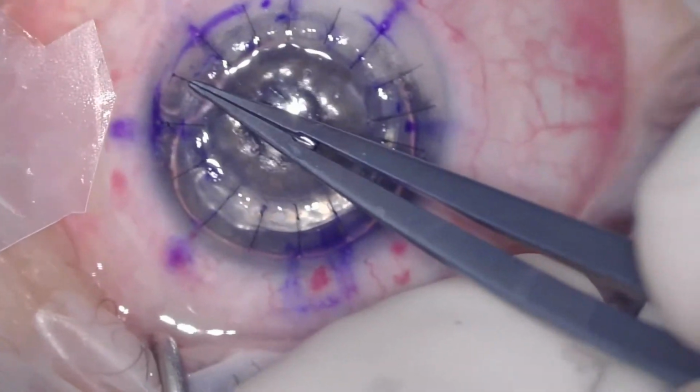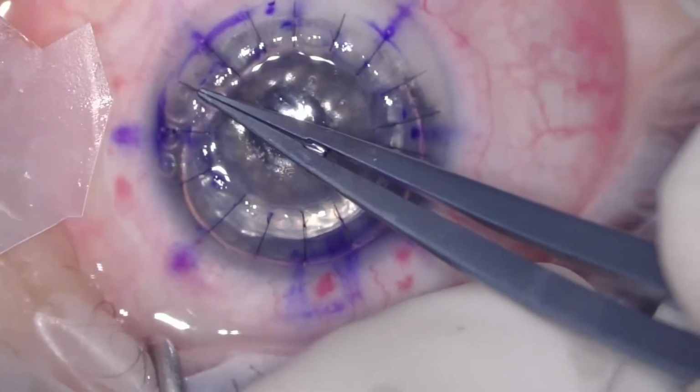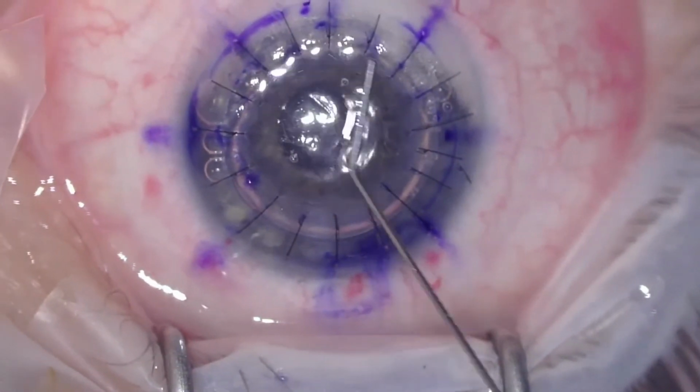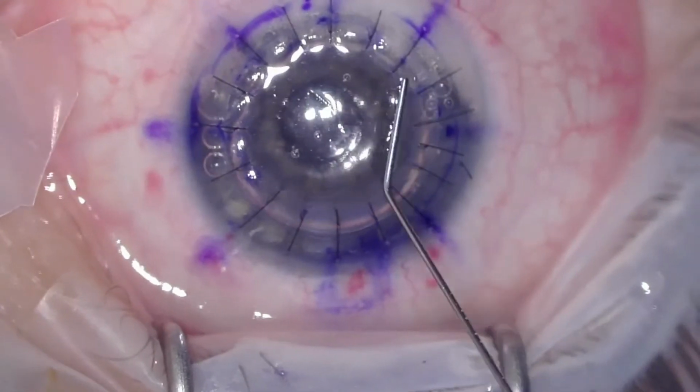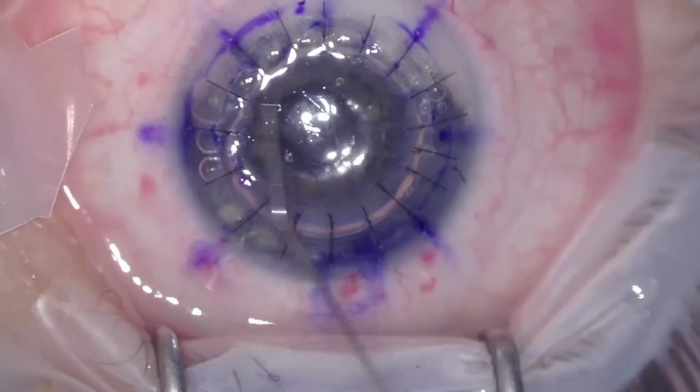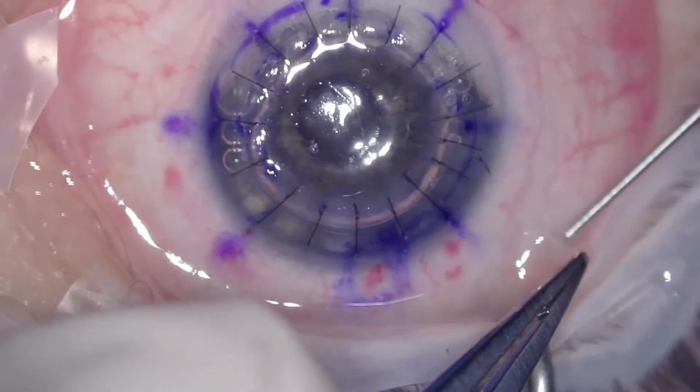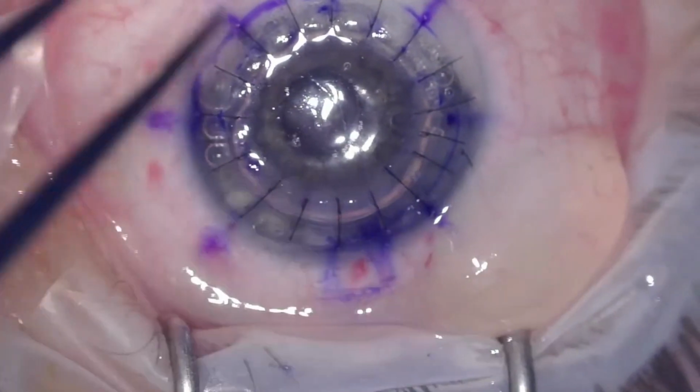I vary again. I tend to leave the knots either on the host or the cornea, but never in the junction. And I'm just using my cannula just to make sure there's no other perforations evident. And I've now released some of the gas. So this is a bit of subconjunctival Kenacort.